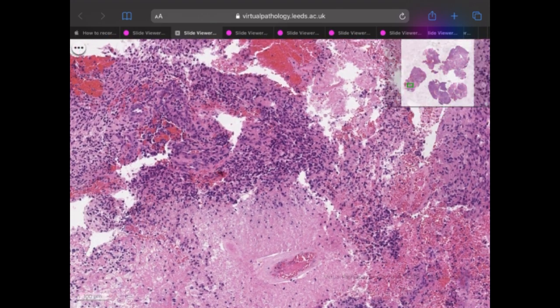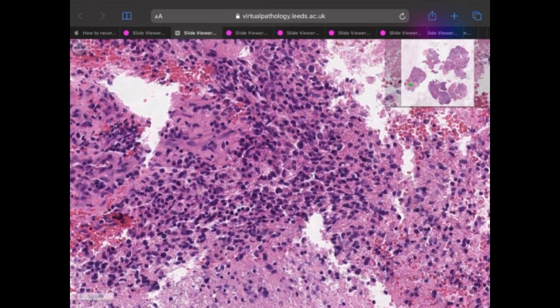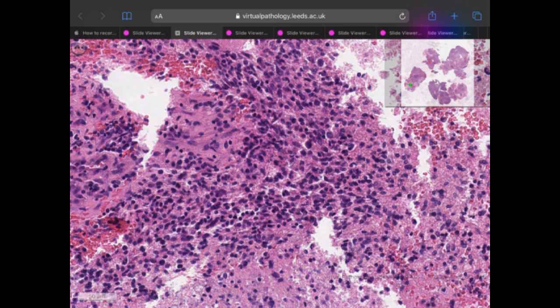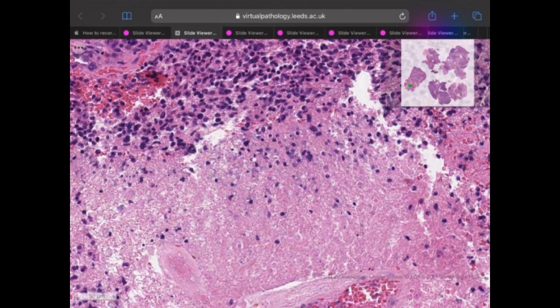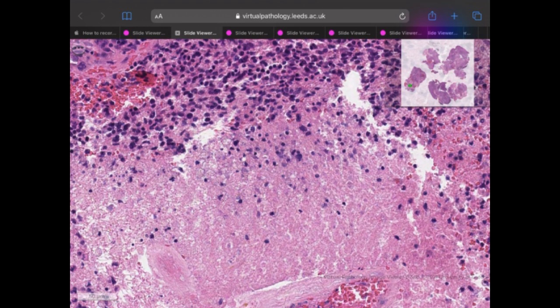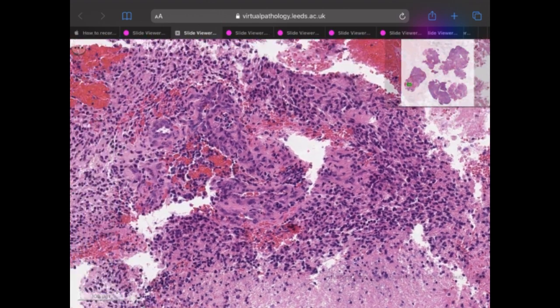When you correlate clinically, and when you see these very pleomorphic cells at the center, they are different in terms of shape and size, and they have this fibrillary background with the presence of necrosis. Even though it's not a palisading necrosis, you can appreciate the dense cellularity at the periphery of the necrosis. Any type of necrosis is a clue, a characteristic for glioblastoma.